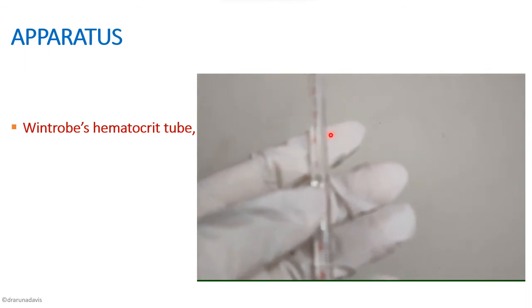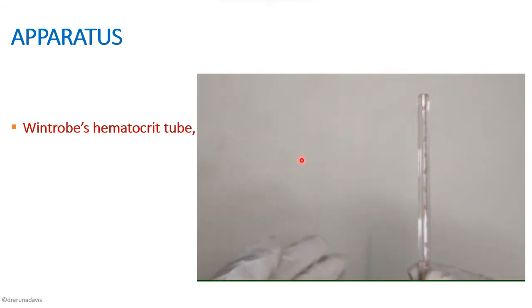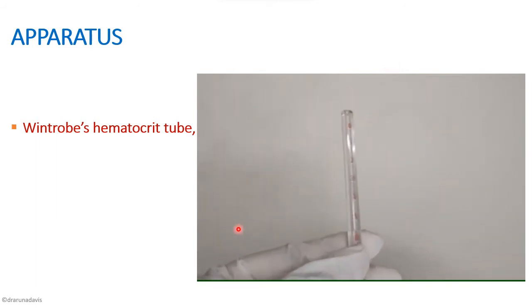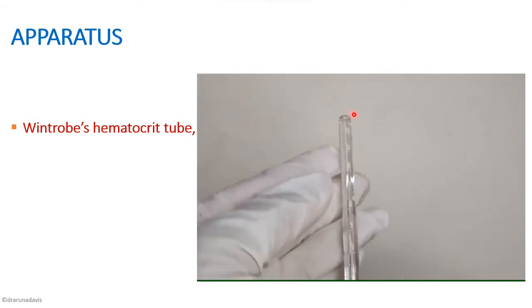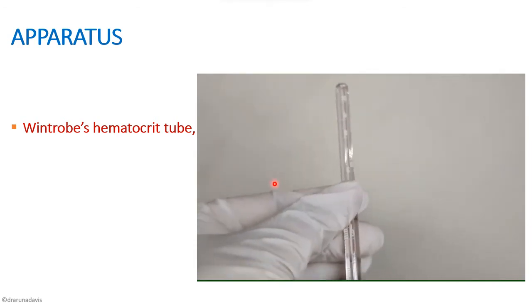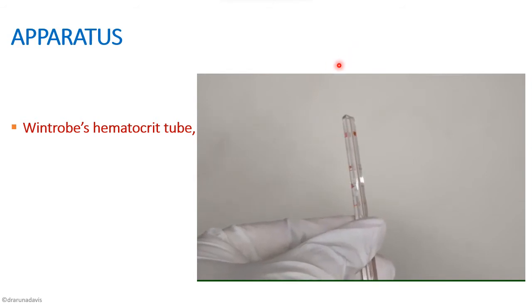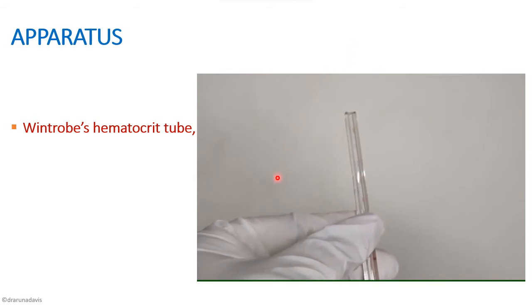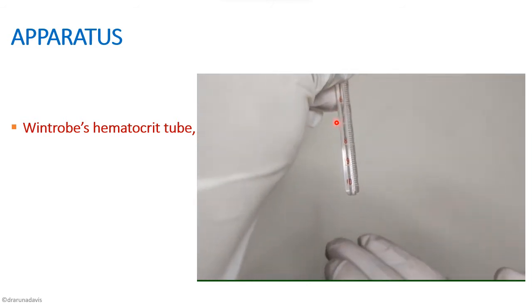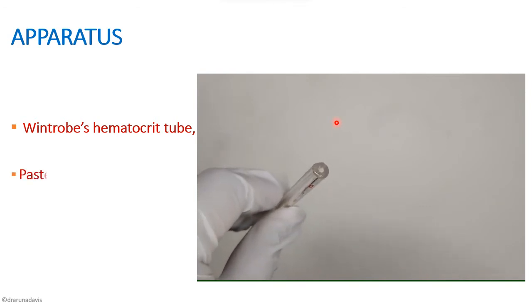The first apparatus we need is the Wintrobe's hematocrit tube. It is about 11 centimeters long, a thick tube with two sets of markings — one in white and one in red. For the red markings, 10 is on the bottom and 0 is on the top, whereas for the white, 10 is on the top and 0 is on the bottom. It is open on one end and closed on the other. We will discuss why there are two sets of readings later.